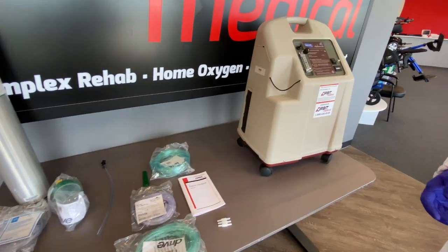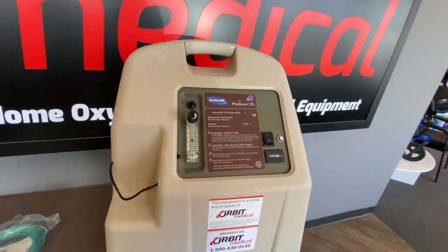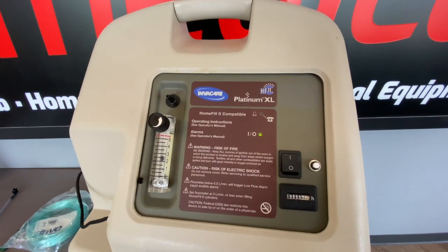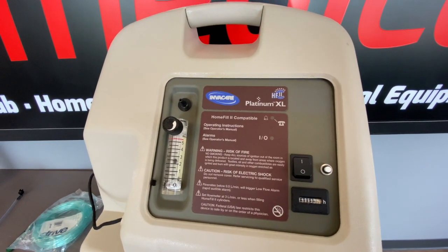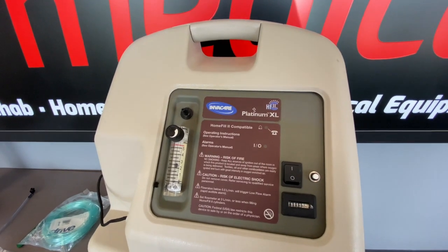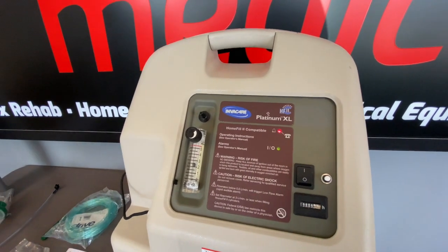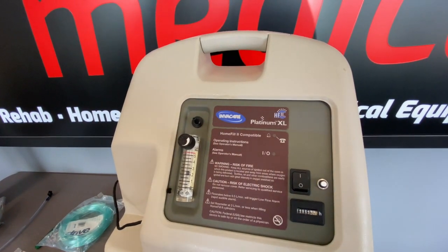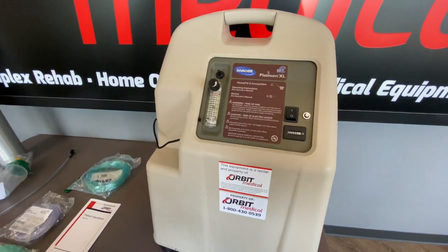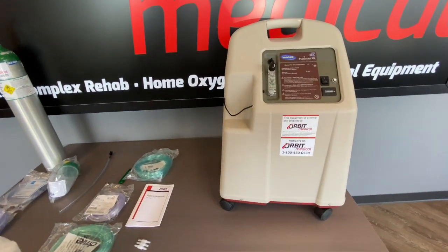What I'm going to do next is simulate a power outage — I'm going to pull the cord from the wall and you should hear an audible alarm. So if you ever hear that alarm, make sure you're checking that the unit is still plugged in and checking your breaker. It is very important to connect the concentrator directly into the wall without using any extension cords or power strips.